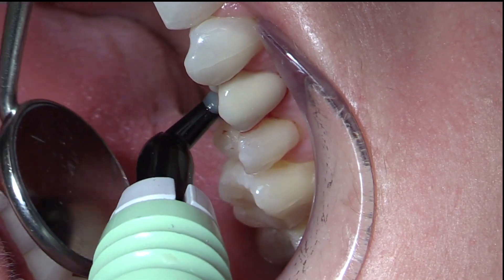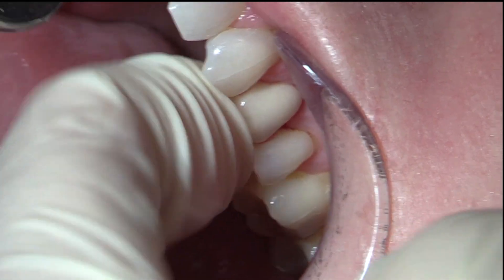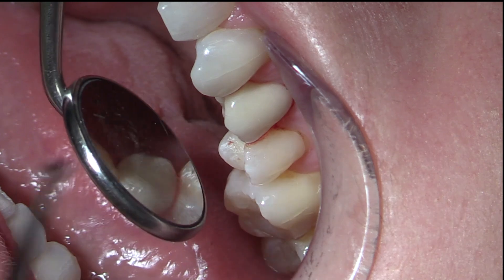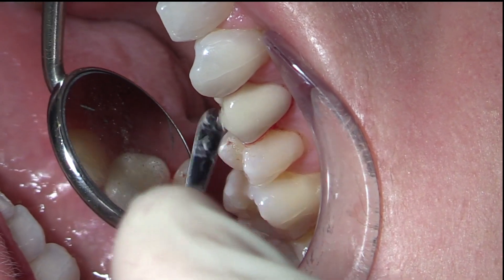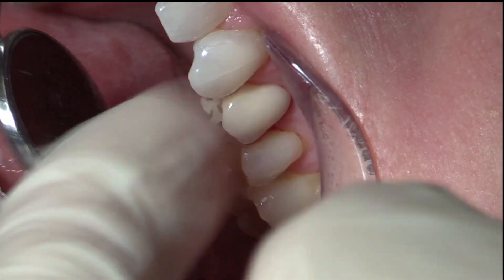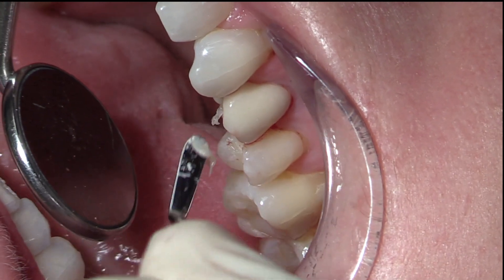If we ever have to take this off again, we now have the ability to come back in and use the OmniGrip driver to get this off — if we had to change it, modify it, or do anything to it. I like the flexibility of this because the other way, I had to destroy the crown in order to get it out. This way, if I had to fix something, I can still do that.